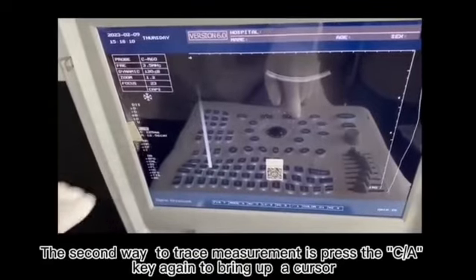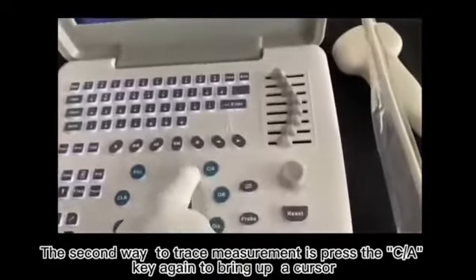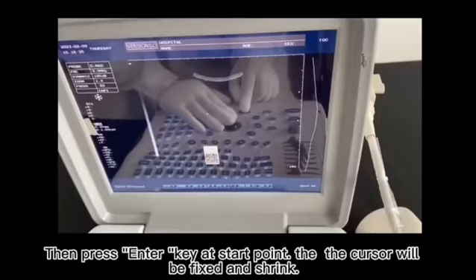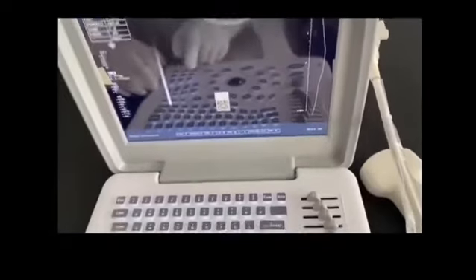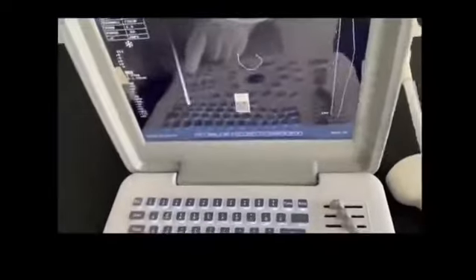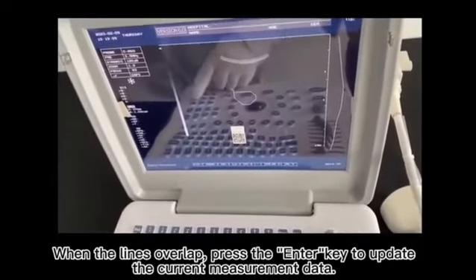The second way is tracing measurement. Press the C/A key again to bring up a cursor. Then press the Enter key at the start point. The cursor will be fixed and shrink. Use the trackball or direction keys to move the cursor. When the lines overlap, press the Enter key to update the current measurement data.